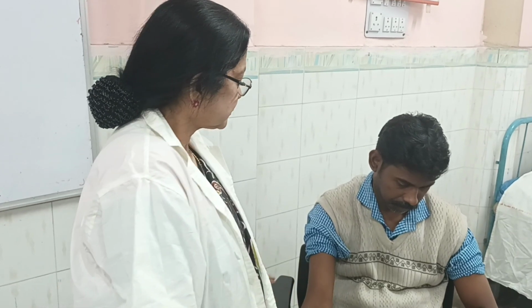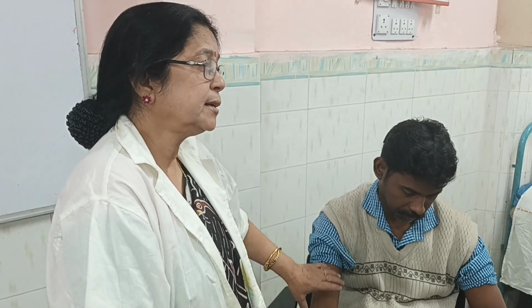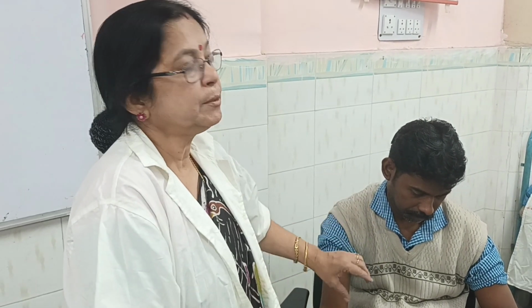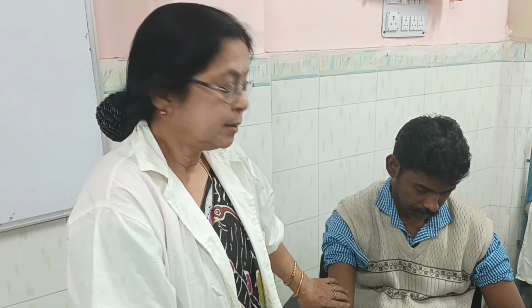And here, if we auscultate and do the palpatory method both over the brachial artery, then both SBP values will be the same. But if we do it over there, there is a gap of 4 to 6 millimeter of mercury to raise up to this.